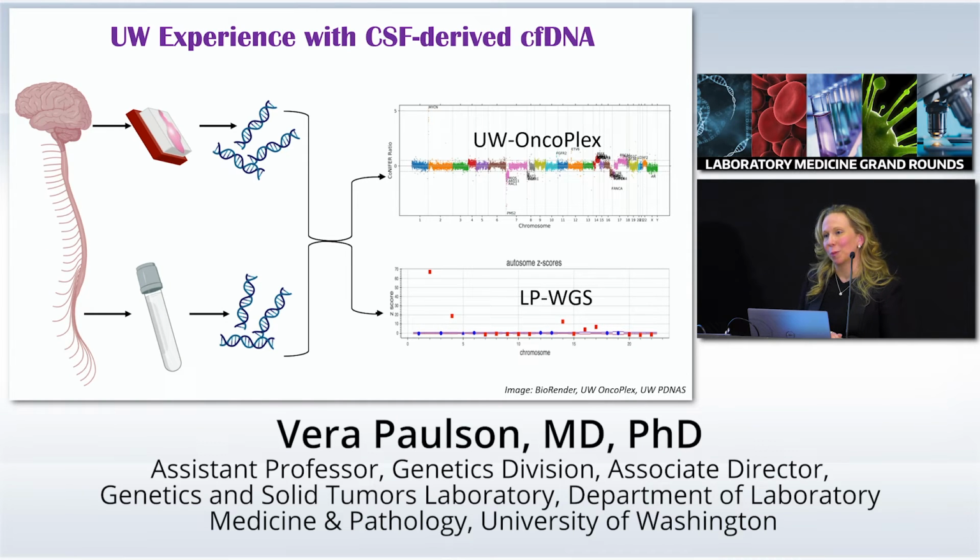We also have a lot of experience on the CSF end of things. I've gotten to work on a number of projects with fantastic collaborators, many who have been kind enough to share some of the slides that you're going to see next. In these assays, we've looked at FFPE and CSF from patients, and then they've either gone on to one of 2 platforms, both of which I've discussed, Oncoplex or our low-pass whole genome sequencing that's used for prenatal testing.